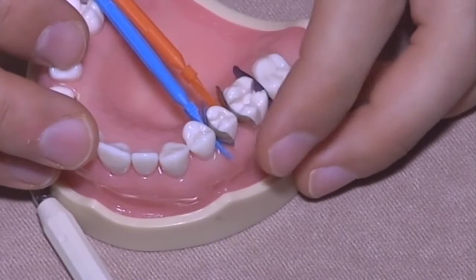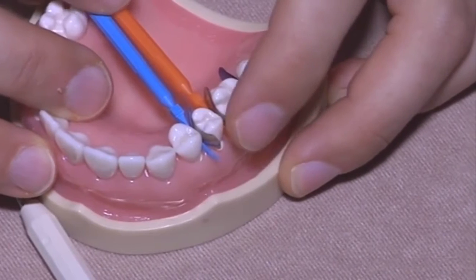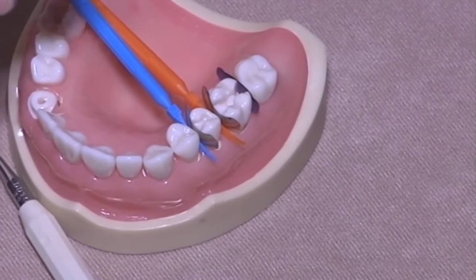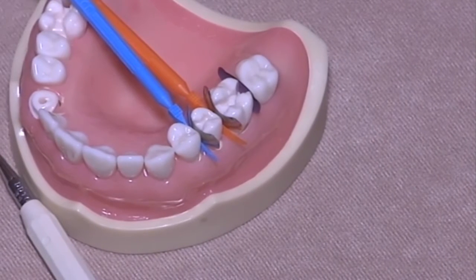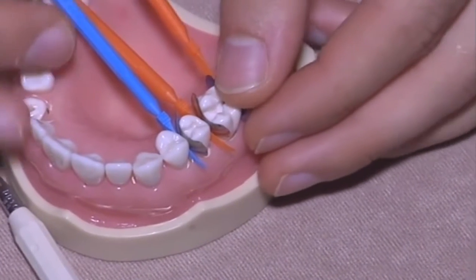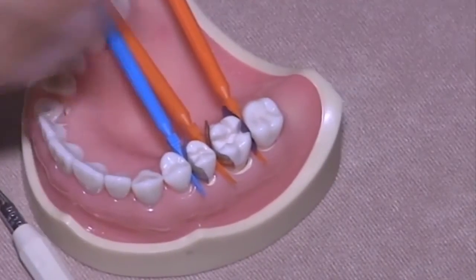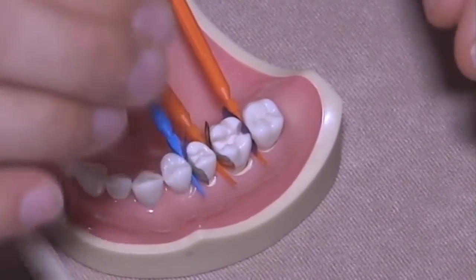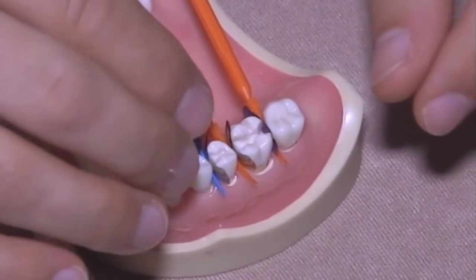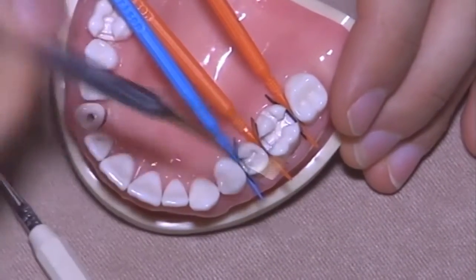I have no clear preference on plastic or wood wedges. Actually, I think that wood wedges are easier to adapt because they are softer than plastic ones, but they work in a good way. Remember that with the sectional matrix, the use of wedges is for adapting the matrix to the cervical area of the cavity.